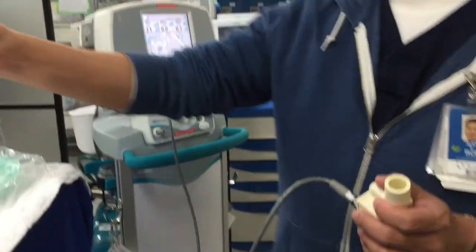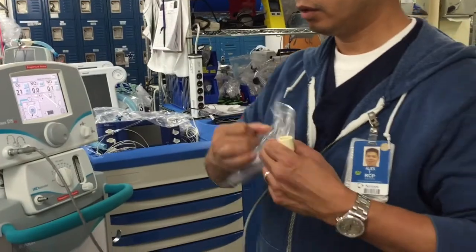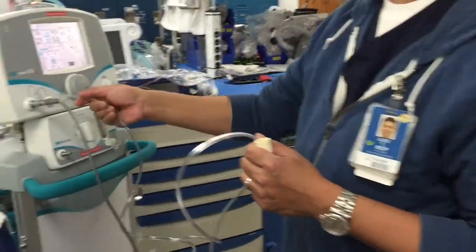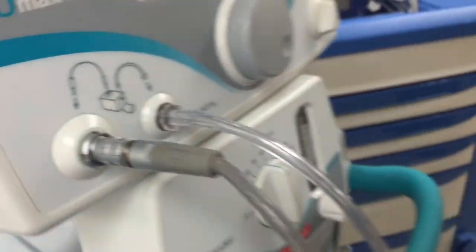Now take the injector tubing. Open it up. The injector tubing goes there and then it goes here.